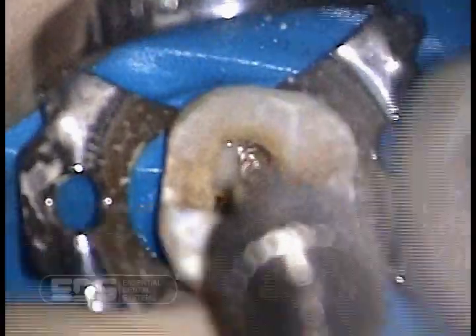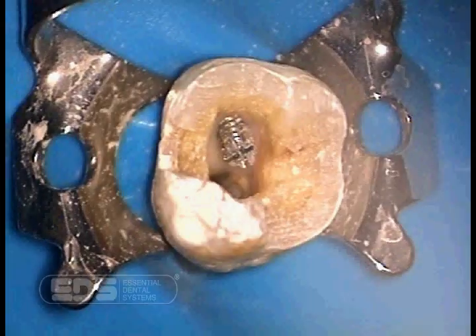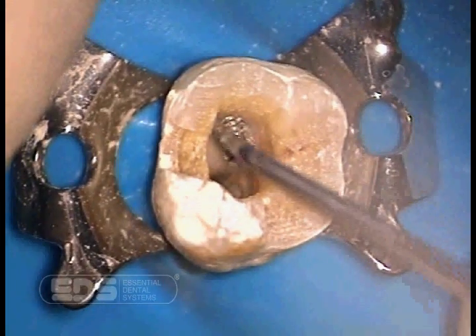Thread the post in until you feel the second tier stopping within the second tier preparation. At that point, we remove the wrench and the post is seated within the tooth. Here we are removing the excess cement.